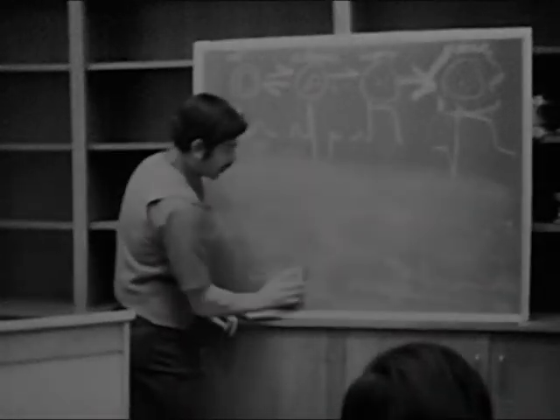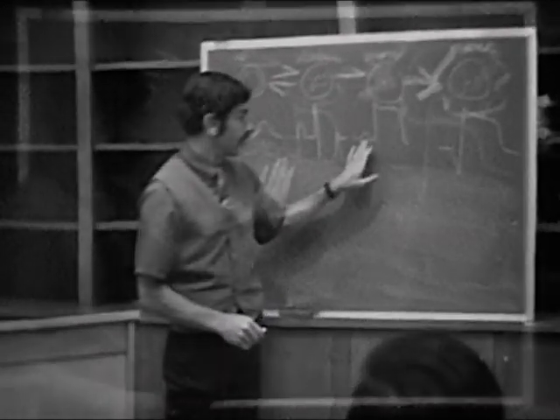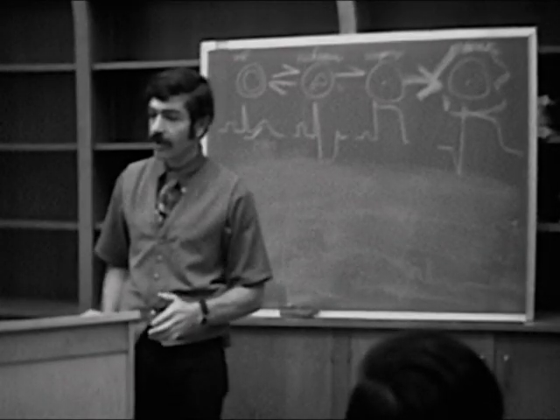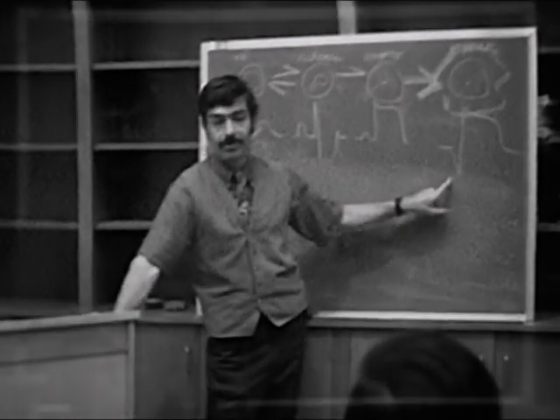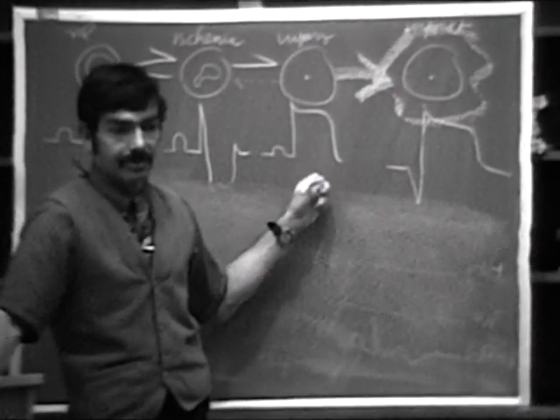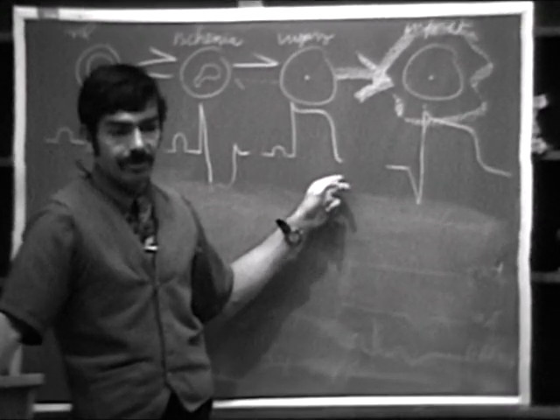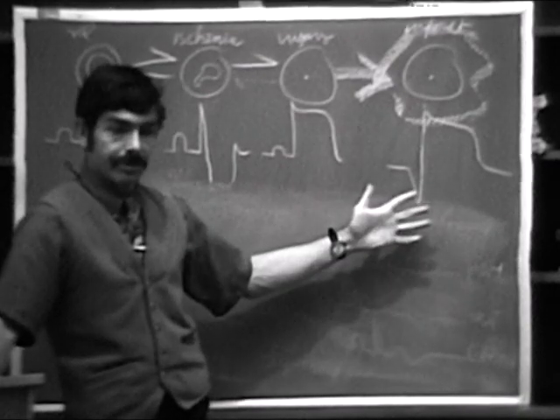All right, well, we've talked a little bit about ischemia now. Let's go on and talk about injury. We've already mentioned that this can reflect an acute infarction before a Q wave has actually developed, before actual muscle necrosis has taken place. Right? That's the classical situation where you develop injury on the electrocardiogram, right? Somebody who's going to go on to infarct.